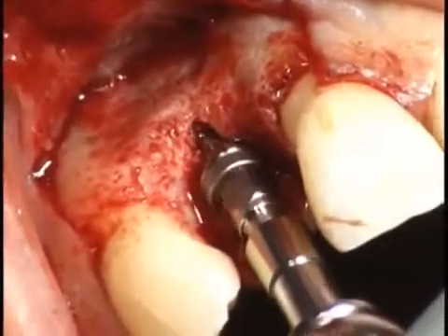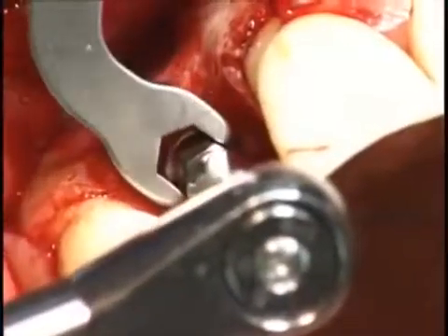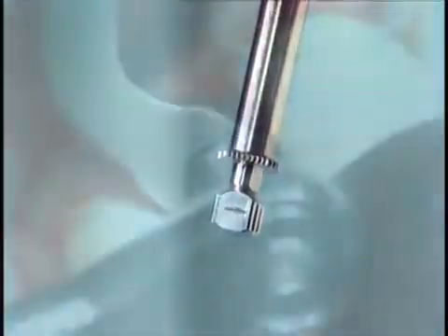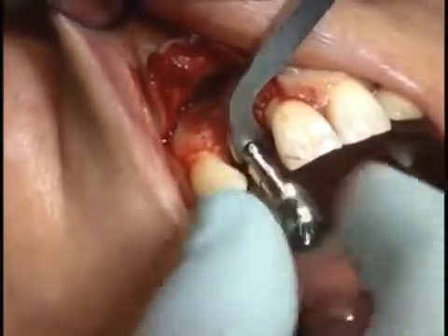After the final position is reached, the holding key is removed and its forked end is put on the hexagon of the transfer part. To release the transfer part from the implant, the arrow on the ratchet must now be set to counterclockwise. The screw connection is released and the transfer part is removed.